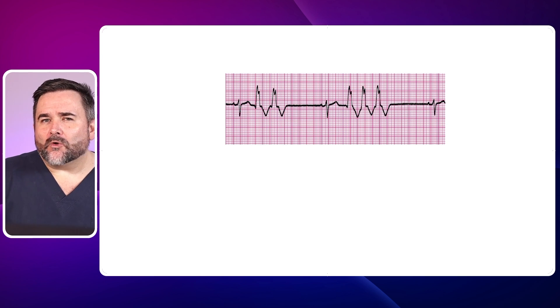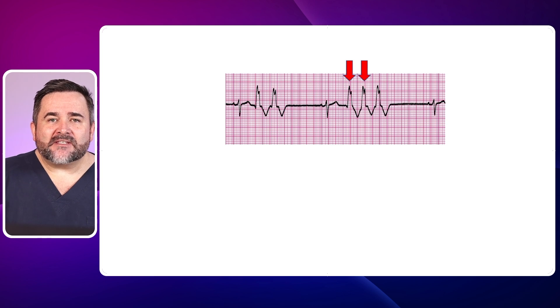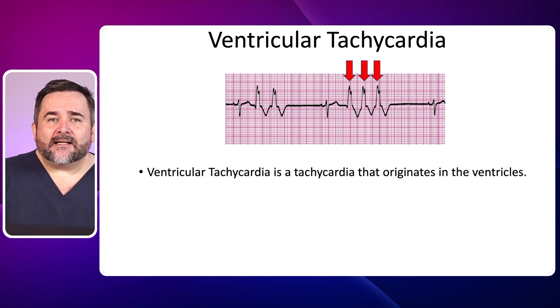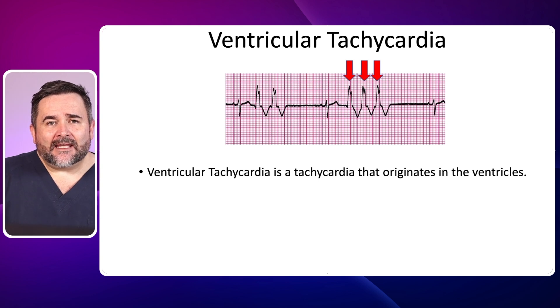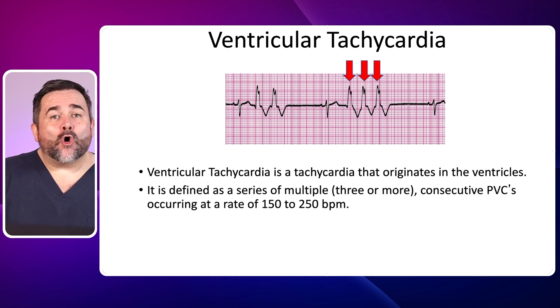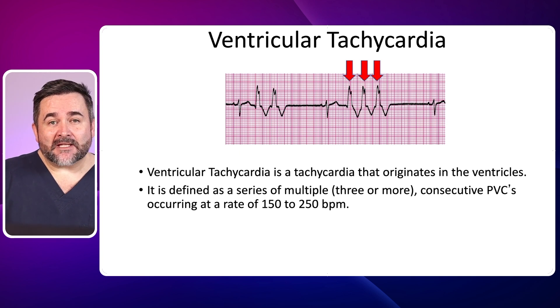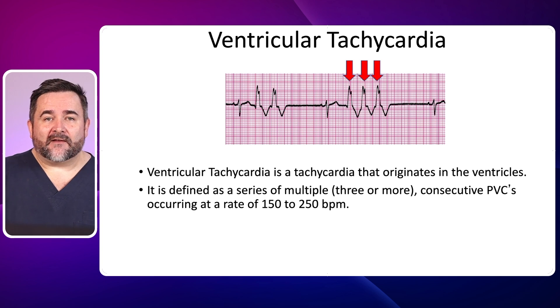What would you call this ECG? Here we see three PVCs in a row — yes, it's ventricular tachycardia. Ventricular tachycardia is a tachycardia that originates in the ventricles. It is defined as three or more consecutive PVCs in a row occurring at a rate of 150 to 250 beats per minute. This is called a run of VT.